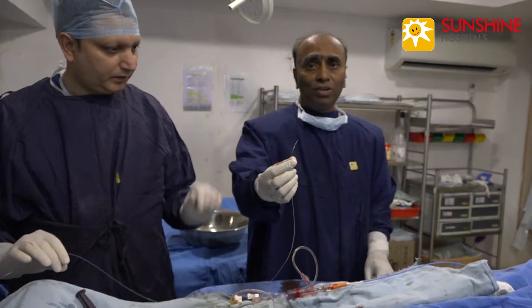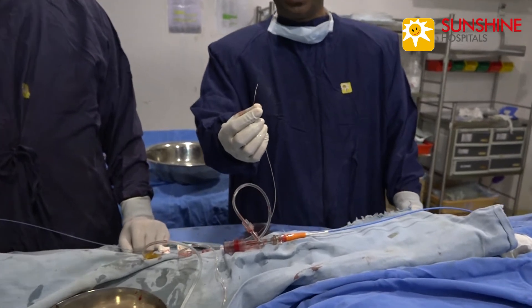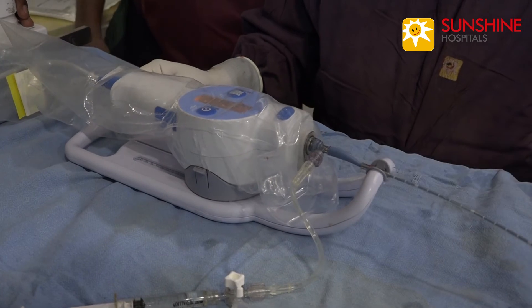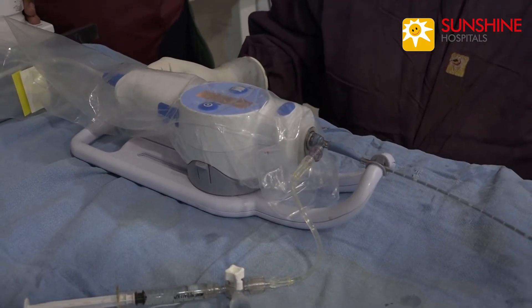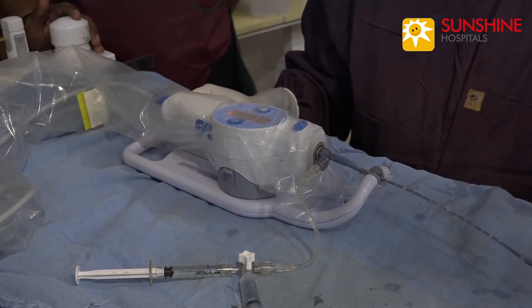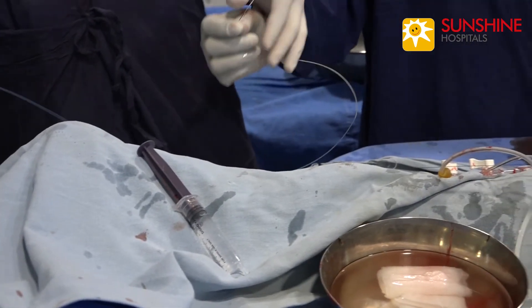The IVUS catheter, called Opti-Cross, is manufactured by Boston Scientific. It is 3 French in size and has a motorized mechanical pullback system. We have to withdraw the Opti-Cross IVUS catheter at the speed of 0.5 mm per second.